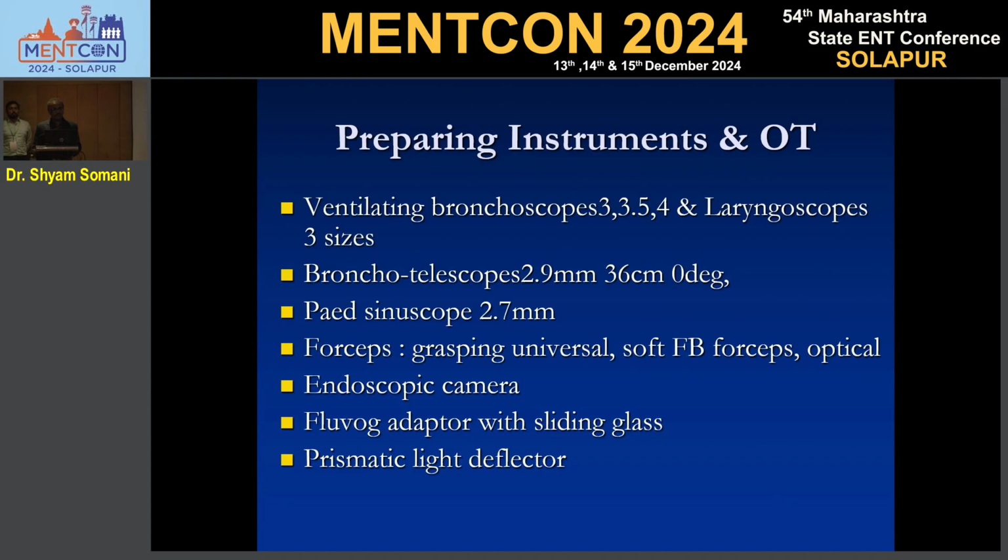Now coming to the surgeon part, we need to have 3 or 4 scopes, 1 above and 1 below. Then forceps 2 each, suction cannula 2 each. See and practice the scope and forceps and duplicate the foreign body if it is possible, and practice your hand coordination with the forceps before you do the scopy, before the anesthetist comes. So this is your job.